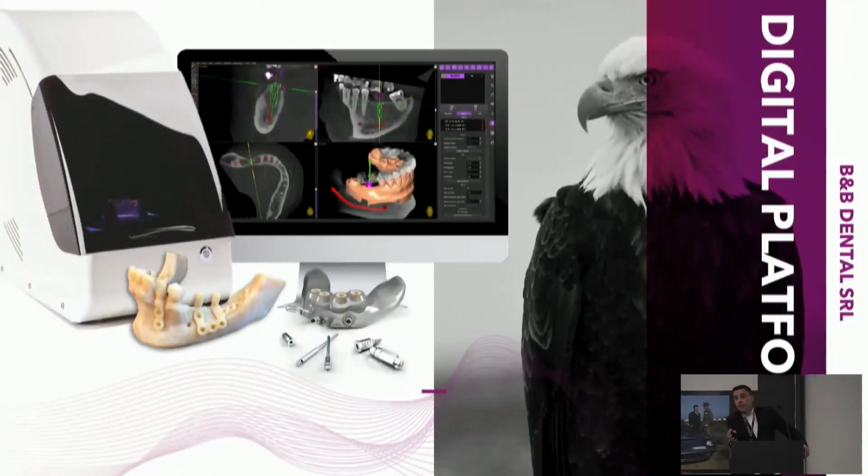Today, B&B Dental wants to introduce you to the new software, the own software of B&B Dental for guided surgery. We're going to see three different things today. The main concept is the B&B Dental software for guided surgery, and the other two things are pterygo implants and Juxta Grid. Just two words about Juxta Grid and pterygo implants, because tomorrow two doctors, Dr. Roy and Dr. Angelo Banzi, will explain how to use this technique. So let's start the presentation.